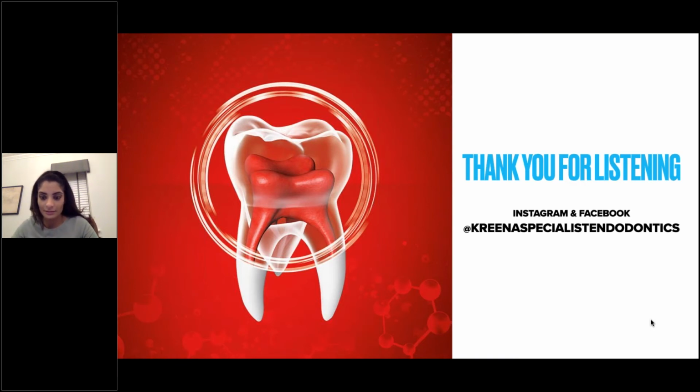Thank you for this great webinar. How does the micro-mechanical aspect of the Biodentine seal form? What is the mechanism of its formation? That's quite a technical question, and I'm sure there are better people to answer that than me. But from what I know, it's a very active site between the dentine and the Biodentine. We have either ion exchange between the Biodentine and dentine, or crystal growth between the two, so you get an excellent seal. It's mainly micromechanical.